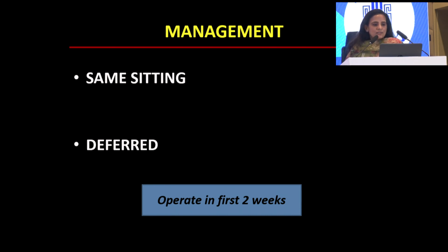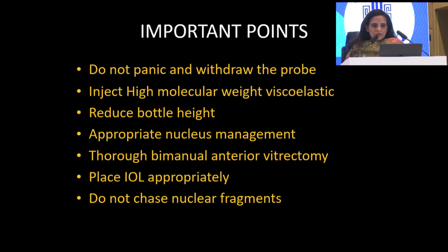So my last slide: the management of a dropped nucleus can be done in the same sitting if you have an in-house vitreoretinal surgeon, but there is no need to panic. Many studies have shown that the visual outcomes are the same whether it is operated in the same sitting or even if you defer the surgery for 2 weeks, provided you control the inflammation and the intraocular pressure. The management is just the same, so there's no need to panic. You just close the case and refer it to the vitreoretinal surgeon to take care of.